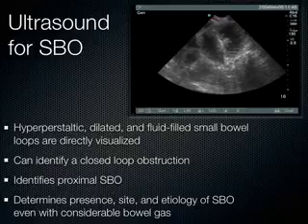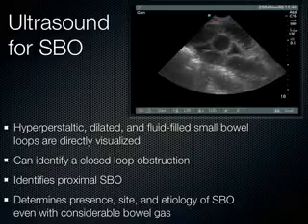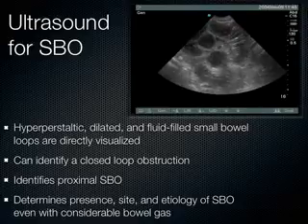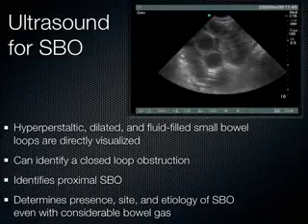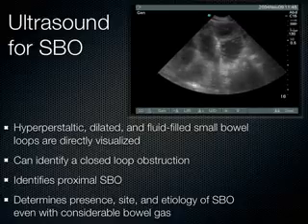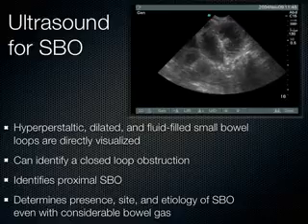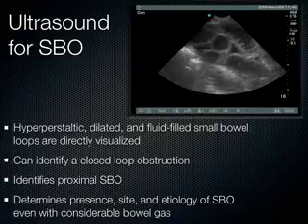And what you see with ultrasound is pretty easy to see, actually. If I've got a patient who's pretty distended, I just walk over with the ultrasound probe, they're vomiting, they've got all the clinical signs of small bowel obstruction. Well, this is what I see. I see these dilated loops here of small bowel. Notice the plicae circularis going all the way across the bowel there. The walls are usually thickened, though sometimes in the early small bowel obstruction, the walls have yet to become thickened.